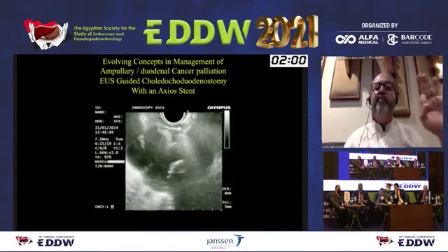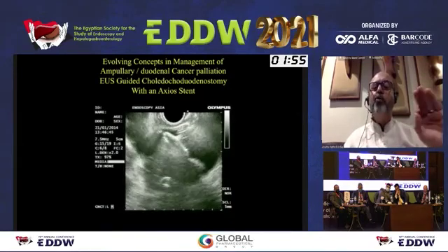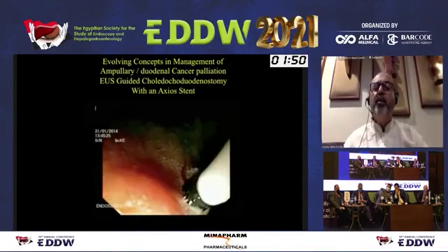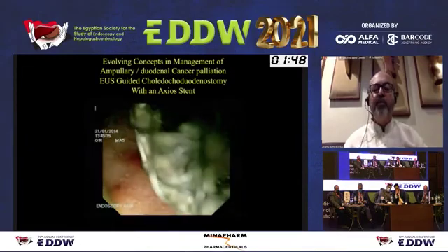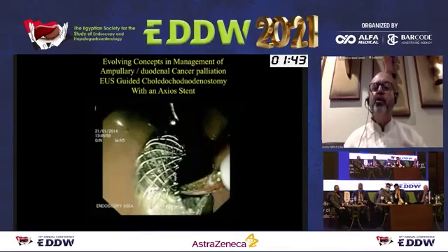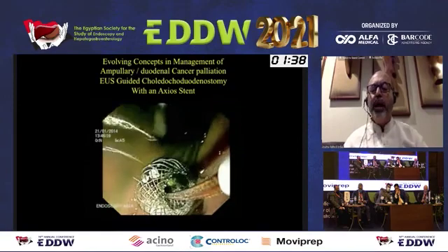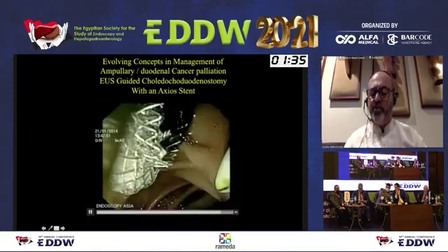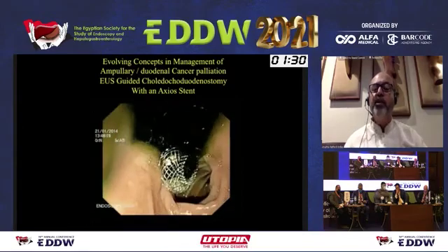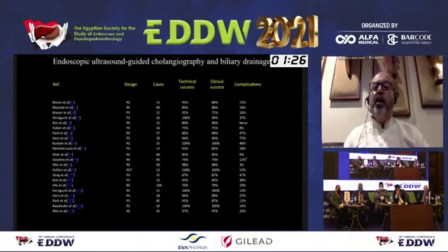So my take here is that if I have a patient with a proliferative ampullary or lower CBD tumor, I would rather go de novo, straight first EUS-guided biliary drainage, no ERCP, put a metal stent, preferably hot Axios like this. Because you are away from the primary tumor, no tumor ingrowth, no tumor overgrowth situations usually happen in such situations. And this is what I feel is the future of palliative care in obstructive jaundice in proliferative lower bile duct tumors or ampullary tumors.